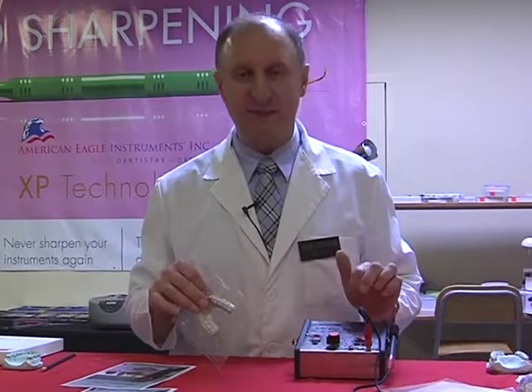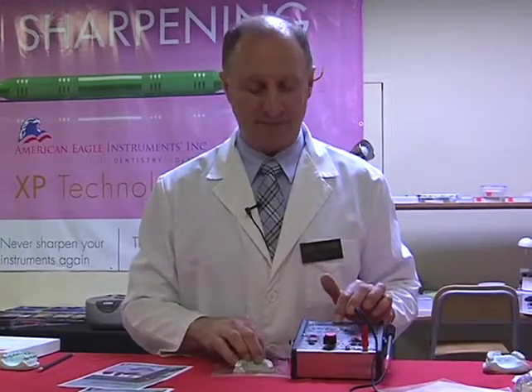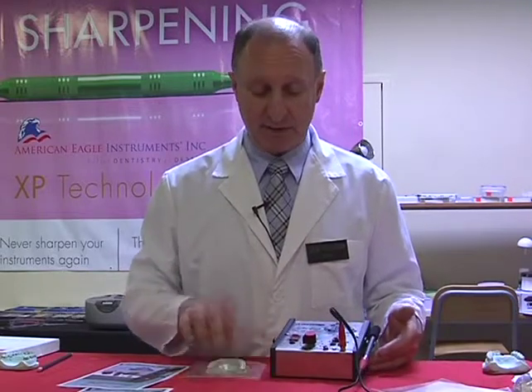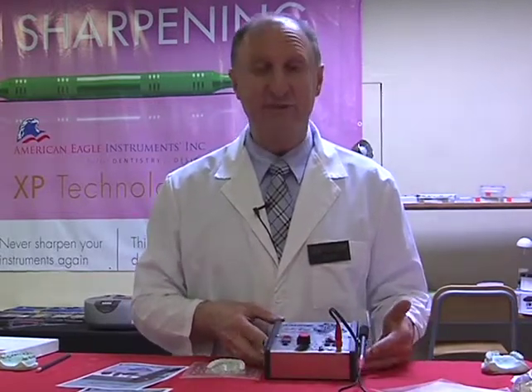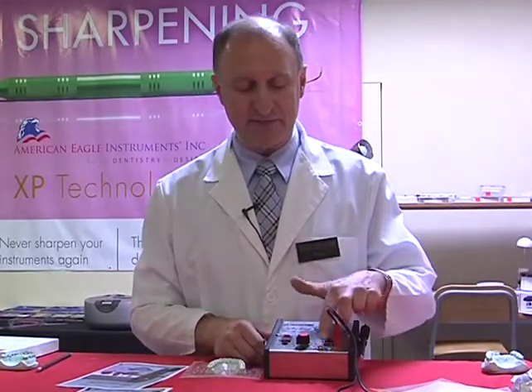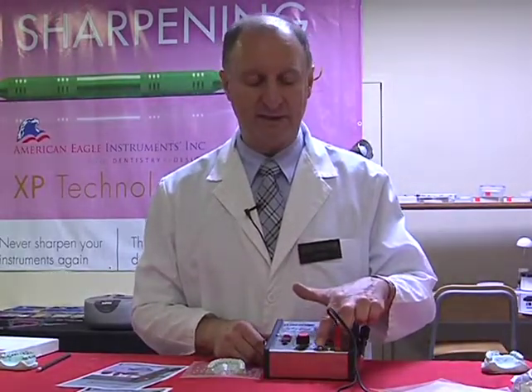In that case, I'm using an instrument called the razor tip. Now this is an item that's made in Saskatchewan, Canada. The company has two different styles of units. I'm using this dual unit, which has a facility to hold another tip in the case.